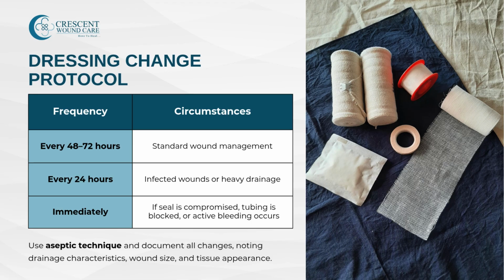the vacuum seal is compromised, air leaks, tubing becomes blocked, or the device alarms. Ensure patients understand that dressing changes may be uncomfortable and offer pain management when needed.